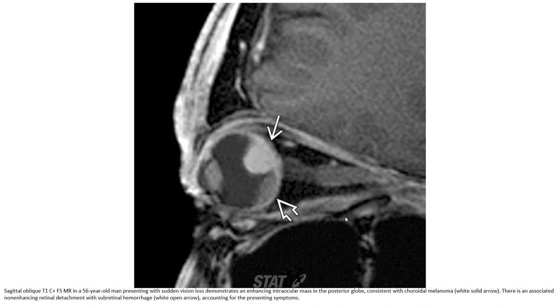This is the sagittal T1 post-contrast with fat suppression in a 56-year-old man presenting with sudden vision loss. It demonstrates an enhancing intraocular mass in the posterior globe, consistent with choroidal melanoma, with associated nonenhancing retinal detachment and subretinal hemorrhage accounting for the presenting symptoms.